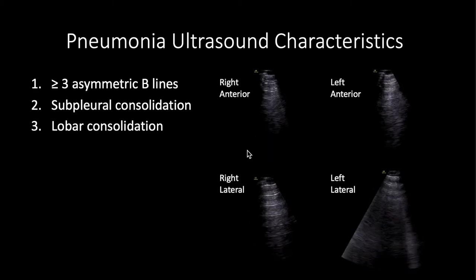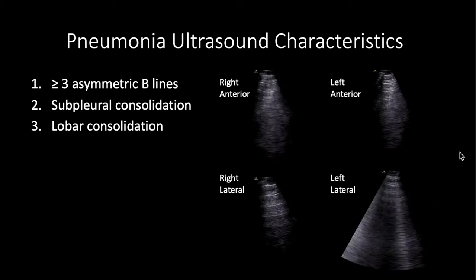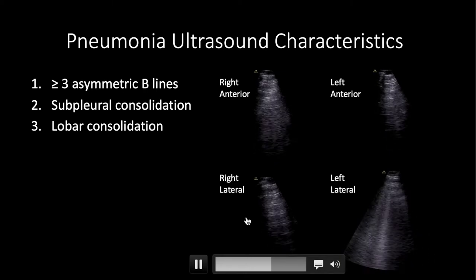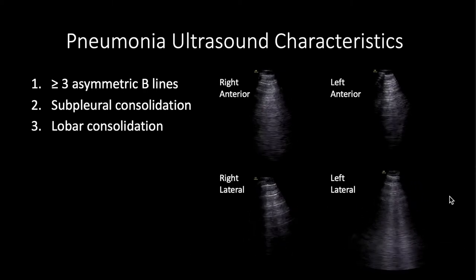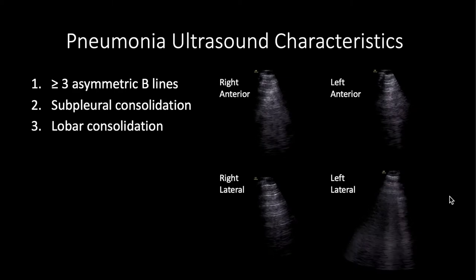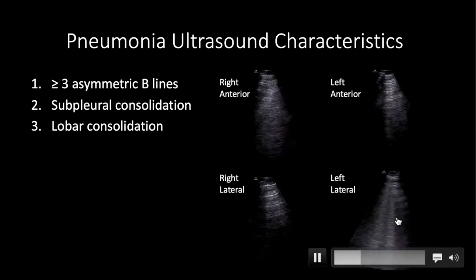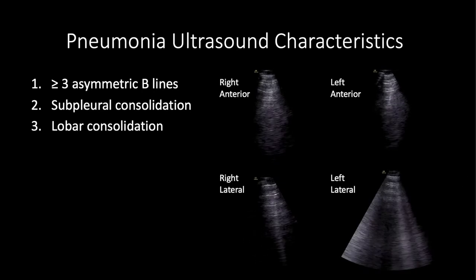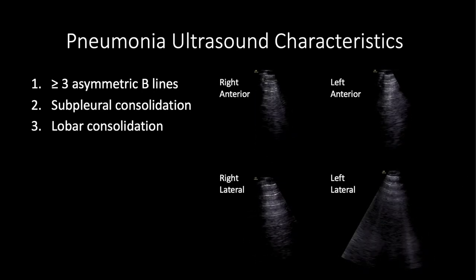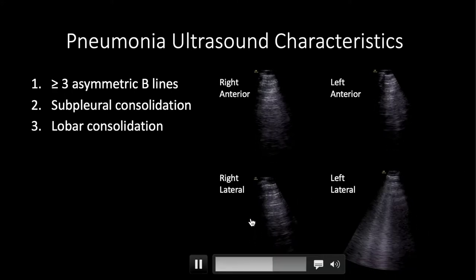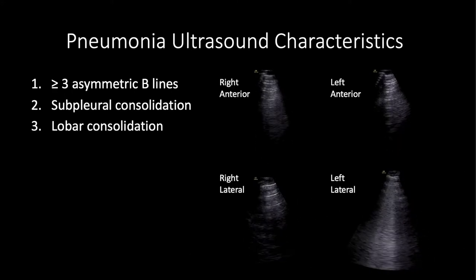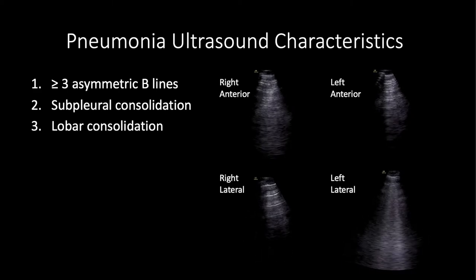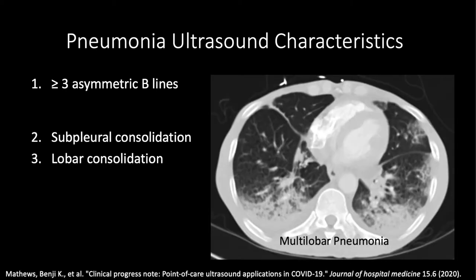Here's an example of an asymmetric B-line distribution. This patient has A-lines anteriorly and A-lines in the right lateral lobe, but when you place the probe on the left side, you have a focal B-line infiltrate. When you have three or more B-lines, it tells you there's a clinically significant infiltrate. This asymmetry is more common with pneumonia and less common with CHF, which tends to be bilateral in distribution.